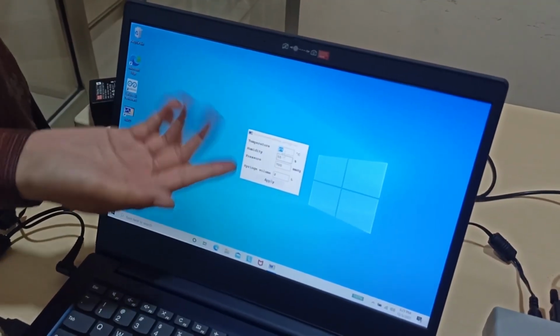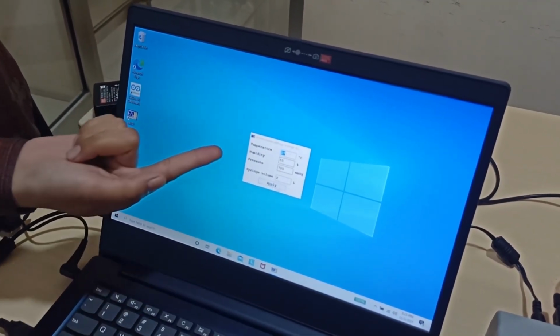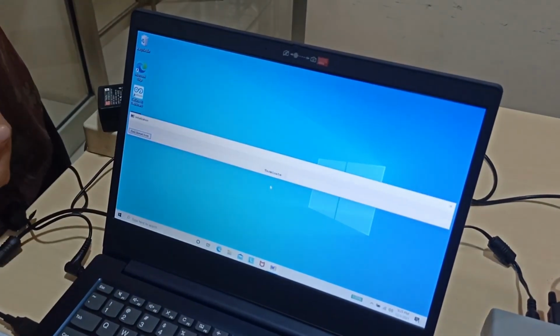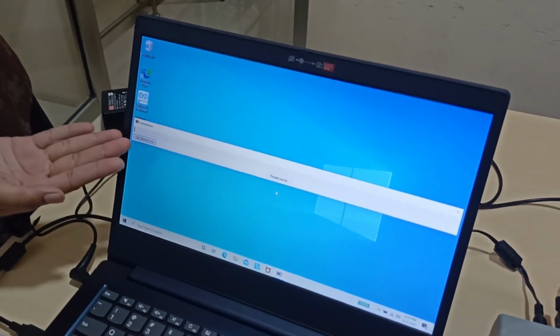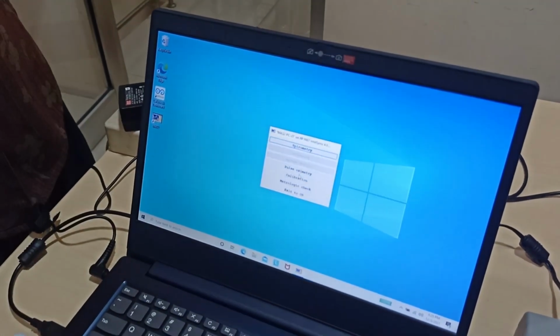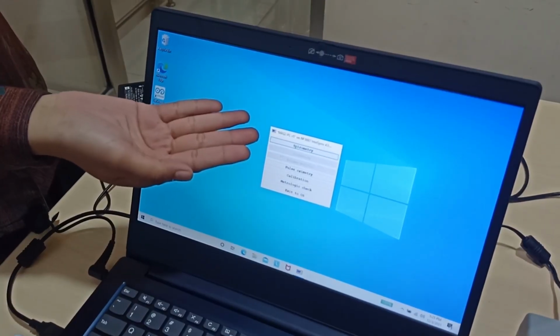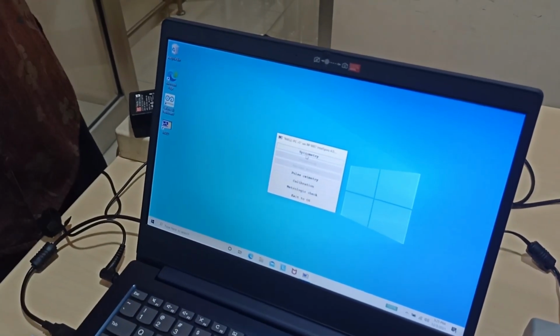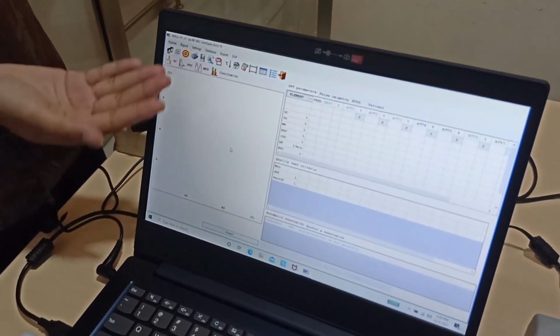Here there will be settings for temperature, humidity, pressure and syringe volume. After that click apply. Here there is no need to click calibration directly. Click terminate selected for this spirometer. The display for the spirometer has appeared.